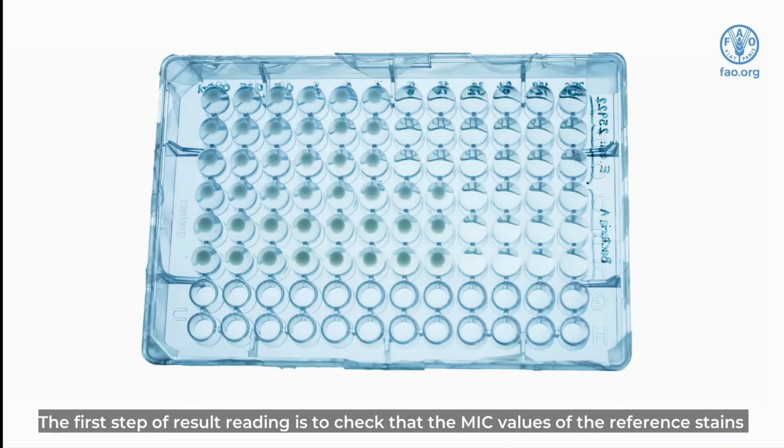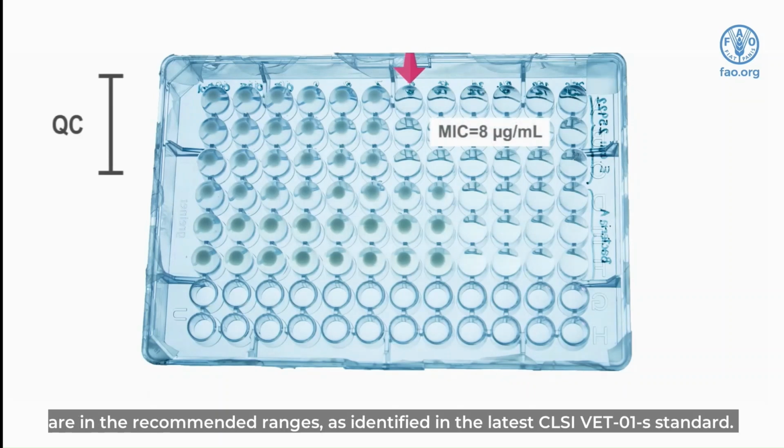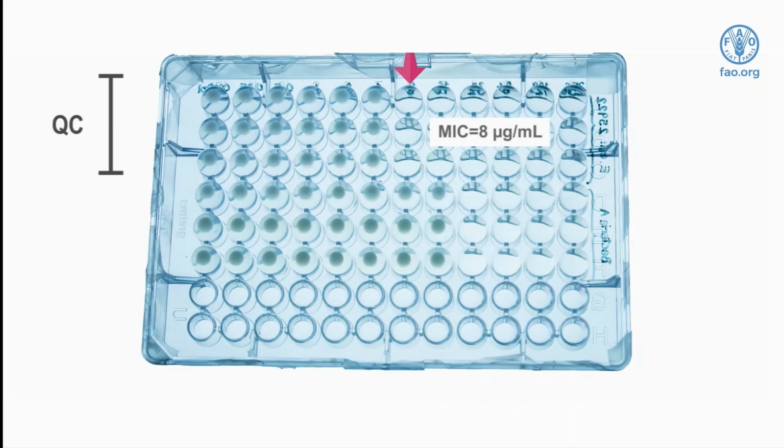The first step of result reading is to check that the MIC values of the reference strains are in the recommended ranges as identified in the latest CLSI VET01S standard.